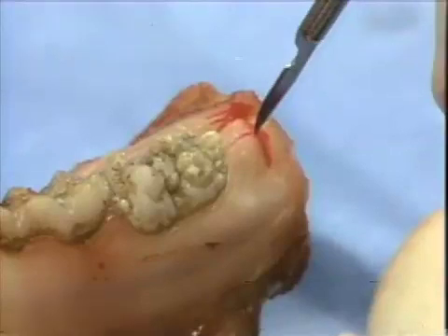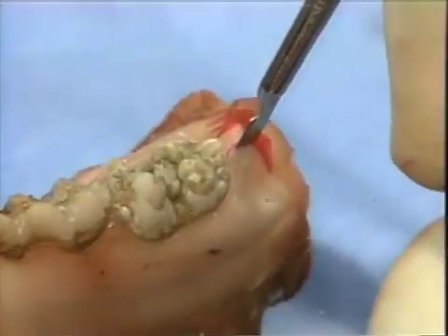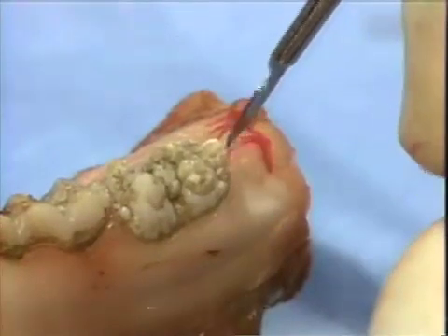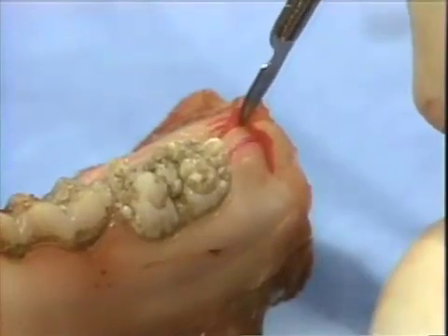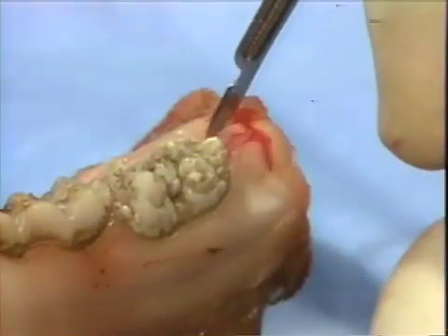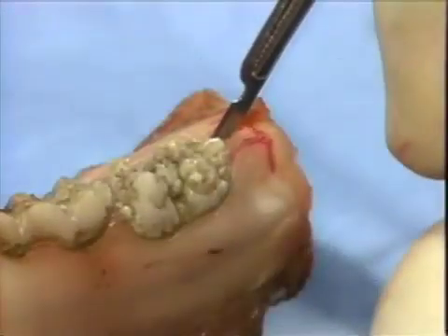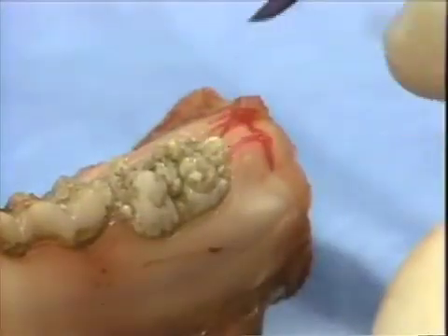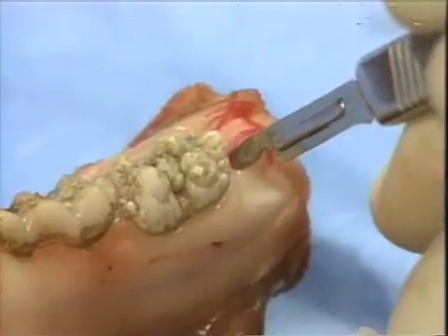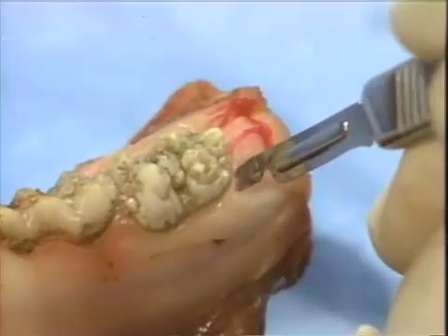Two parallel mesial to distal incisions will be placed. The initial incision is placed down to the osseous crest, both on the lingual and buccal. The distance which separates these two incisions will be determined by the presentation of the periodontal problem.